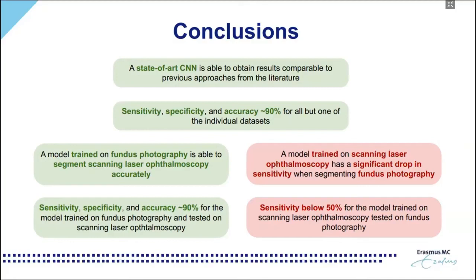Finally, a model trained on Fundus Photography is able to segment scanning laser ophthalmoscopy accurately, with values around 90% for sensitivity, specificity, and accuracy. The same cannot be said for the model trained in SLO and tested on Fundus Photography, which shows a drop in sensitivity below 50%.